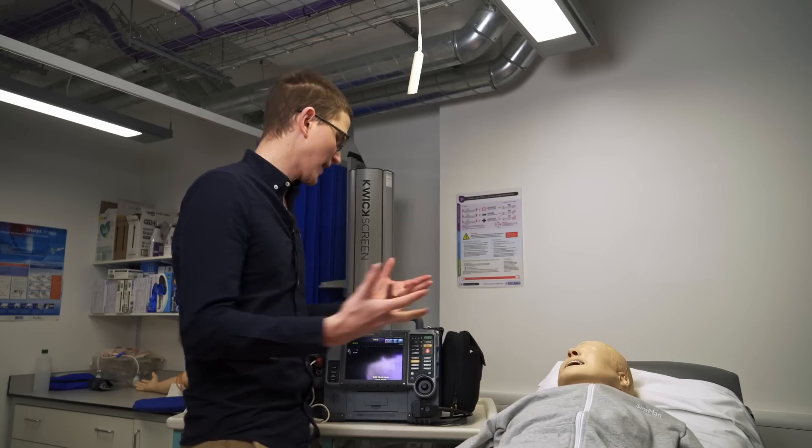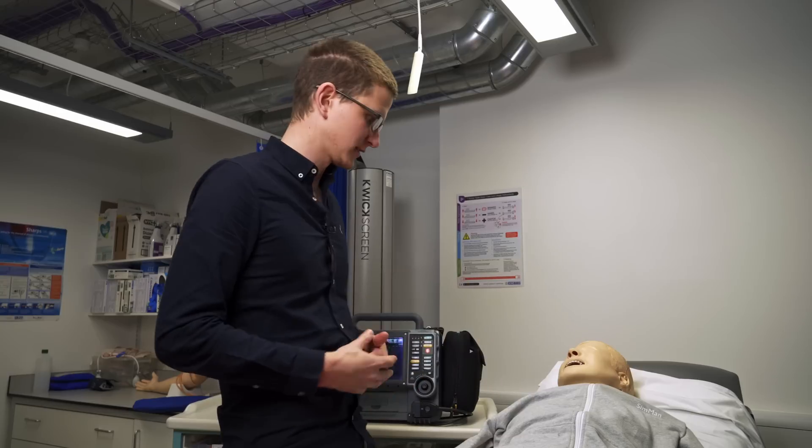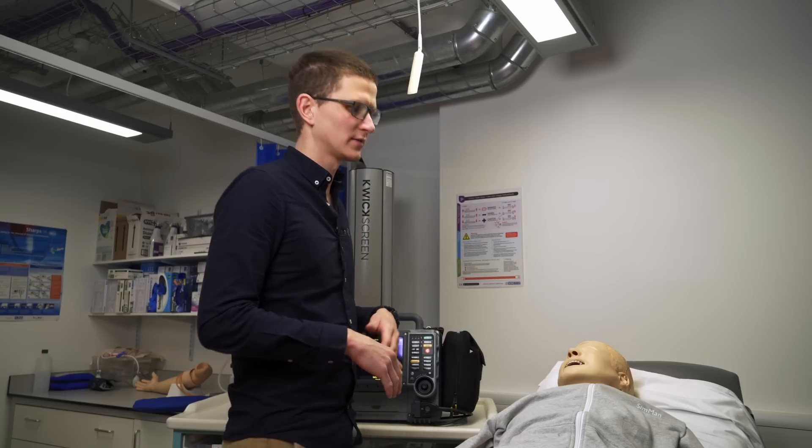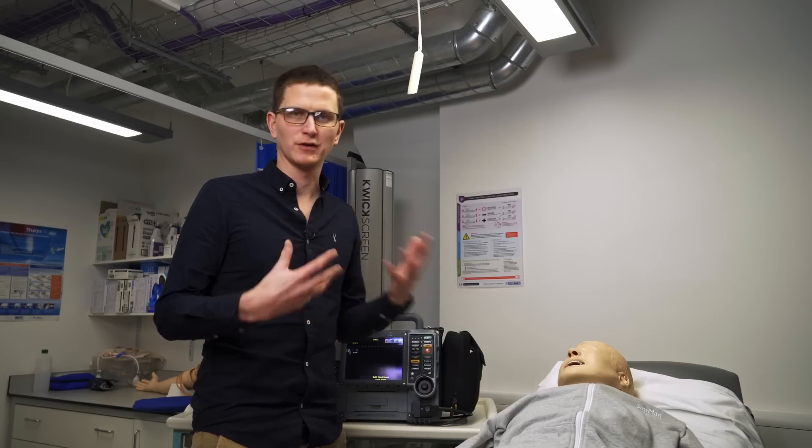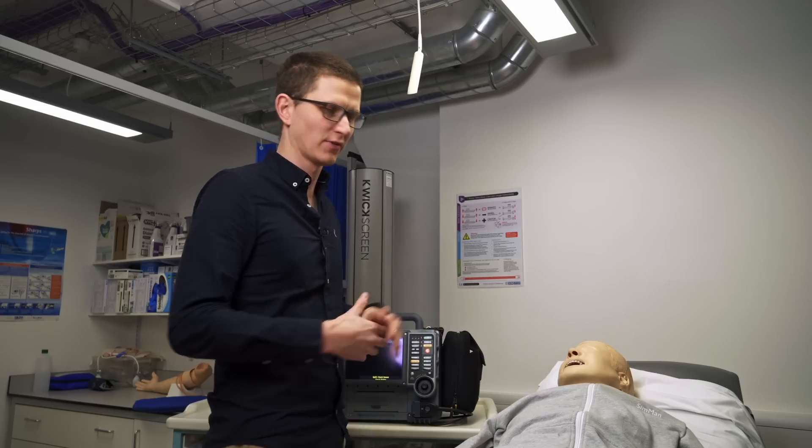We're going to go through the indications, how it works, the process. Different places, different trusts, different services will have different protocols with specific joules, so I'm not necessarily going to be focusing on those specific numbers right now.